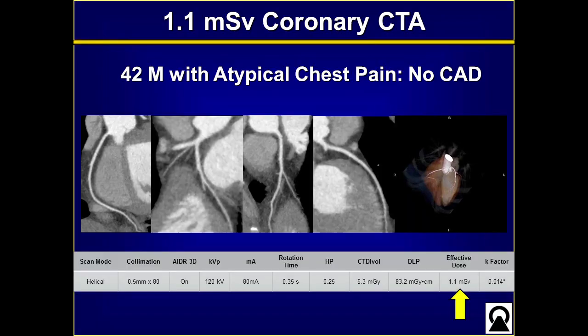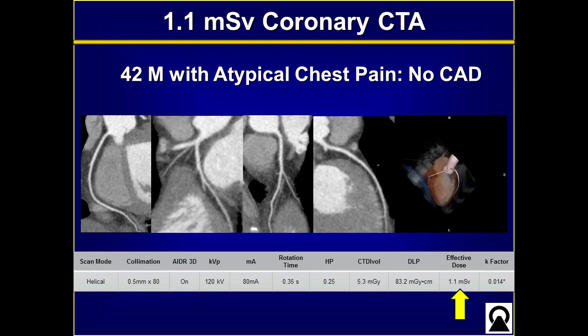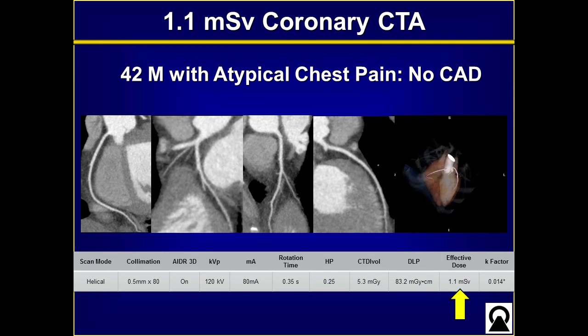Similarly, in my practice we do a lot of coronary CTA, and we can use the dose advantages to get very low-dose coronary CT images. Here's a 42-year-old man with atypical chest pain — a youngish individual concerned about radiation — and you can see he's got no coronary artery disease. His right coronary artery, circumflex, and LAD are beautiful images with just 1.1 millisieverts of radiation. Beautiful images, easy diagnosis to make.